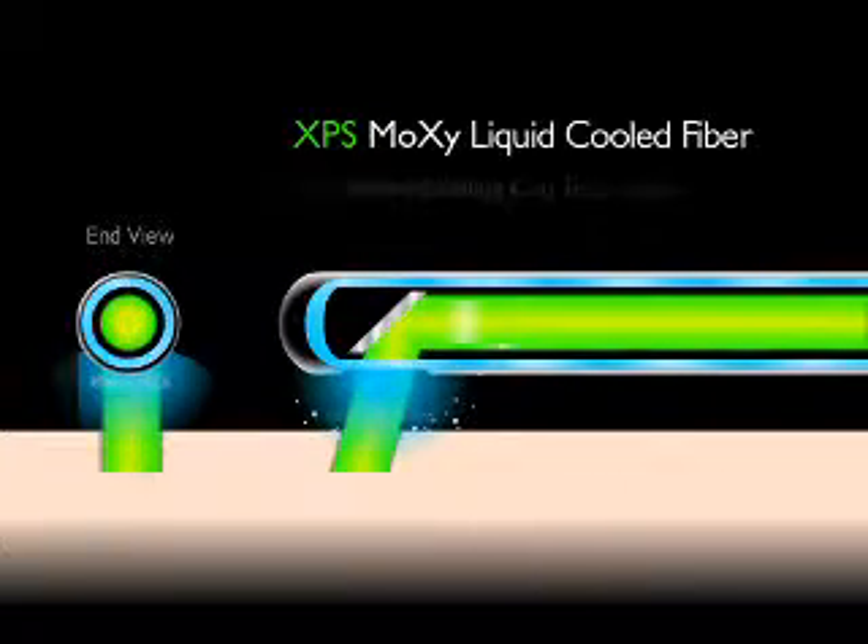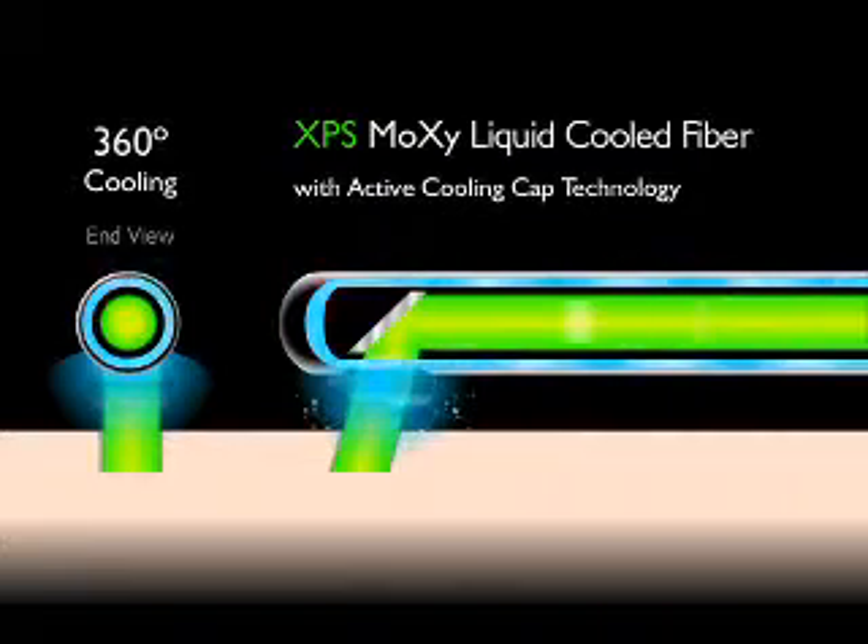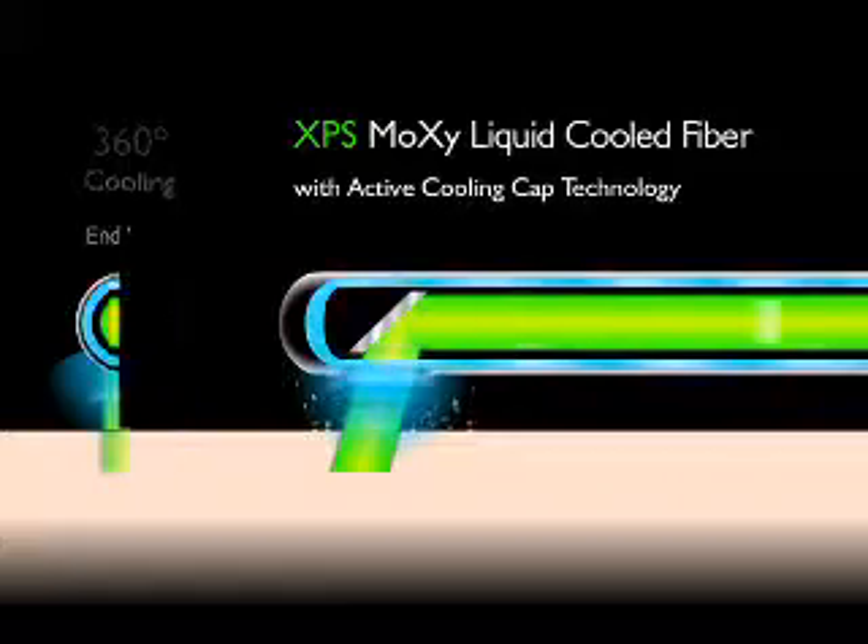Saline flows over and around the fiber, between the fiber and a stainless steel cap. At the tip of the fiber, saline flows out a window in the metal cap, through which the laser beam also exits.